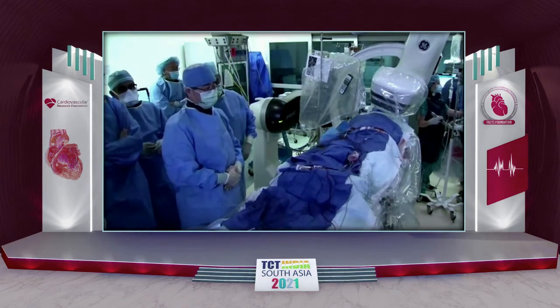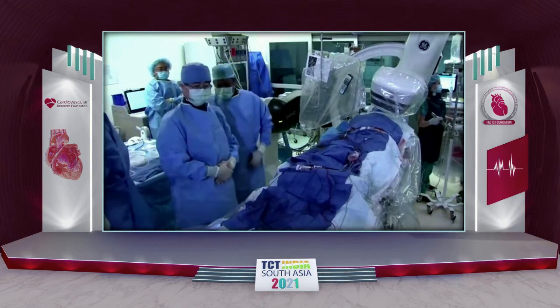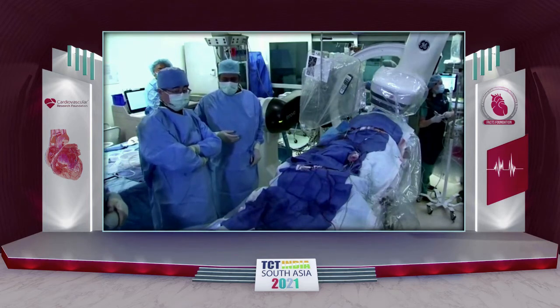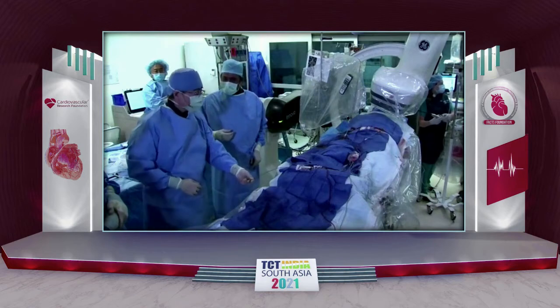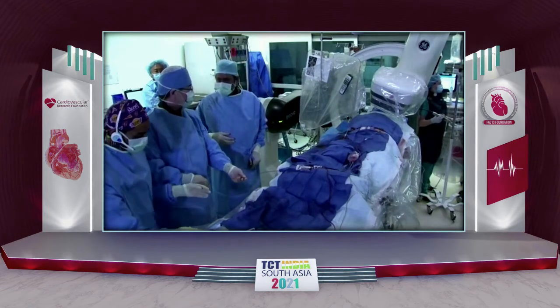Raj, thank you, sir. Can you show if you had anything in the filter for those who don't use that? Do you routinely look if you had any debris in it? To be honest, we don't routinely look, but in fact, last time we were doing a live case, they wanted to look at it and we looked at it. And actually it so happens that there was a piece of calcified material in the filter, just about a week ago, when we did another transmission.